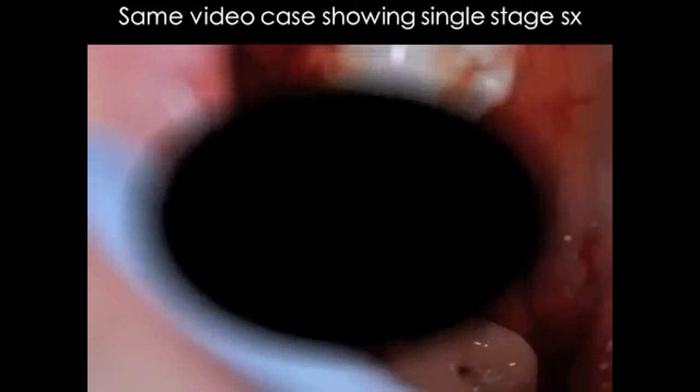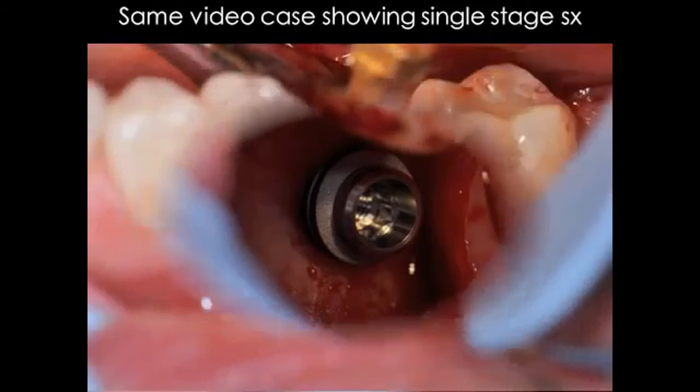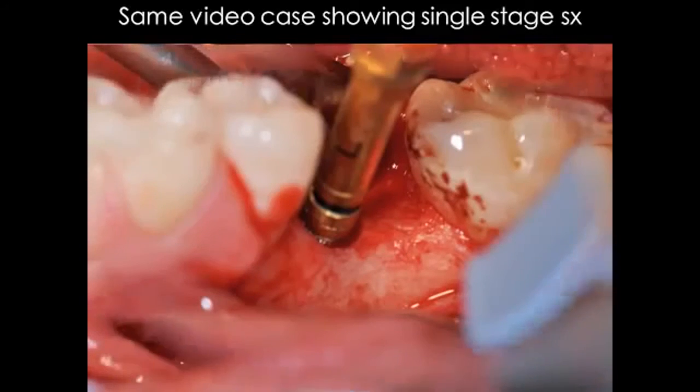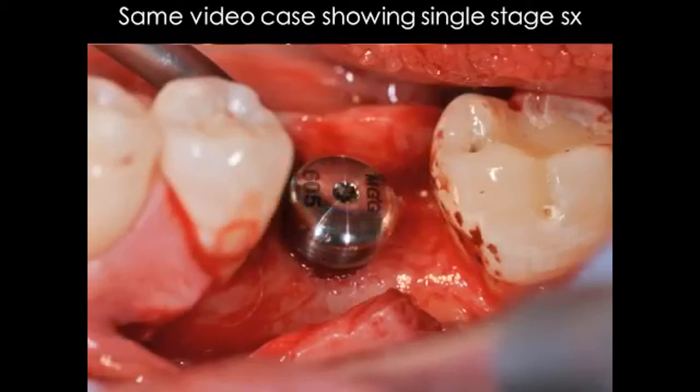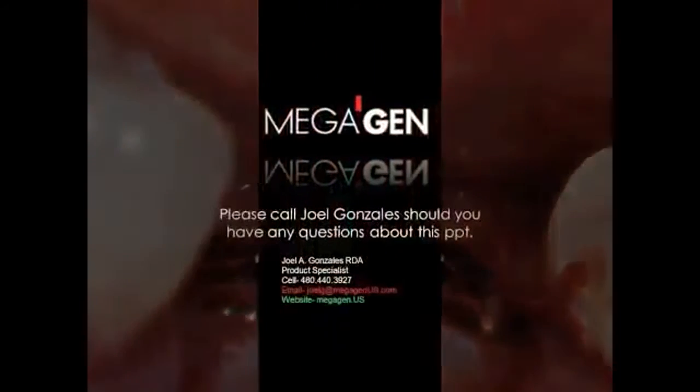The video you just saw emphasized the high torque values that you can get with this particular implant. That torqued out immediately at 50 Newton centimeters. You can see the implant is about 2 millimeters high. There's your ratchet adapter into place, placing it to its final depth, and your single stage process that you can utilize because of the high torque values. Nicely molded gingival aspects around the implant.